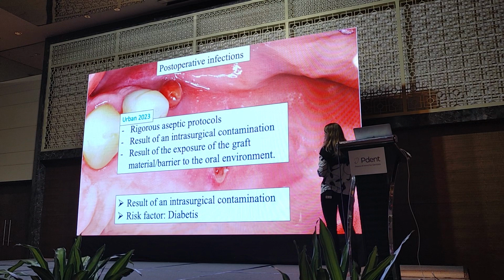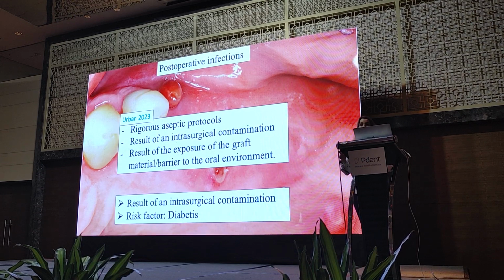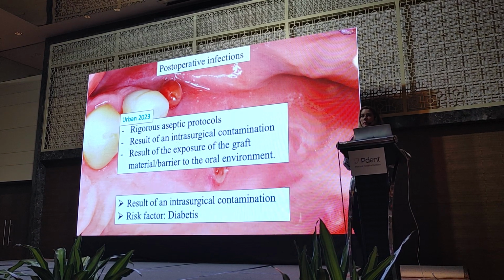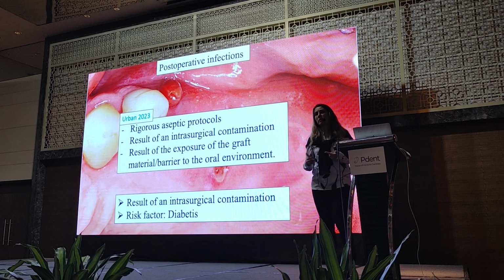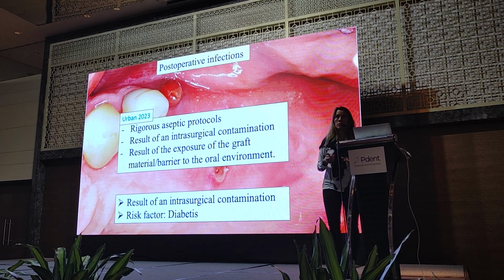The first problem is the aseptic protocol. These grafts with these membranes are very, very sensitive to asepsis. I did many surgeries before using this membrane. I did many blocks. I never had any problems, so I know the surgery.